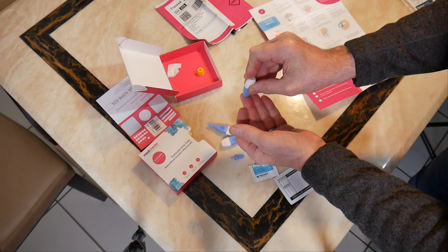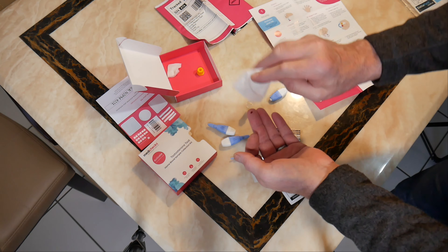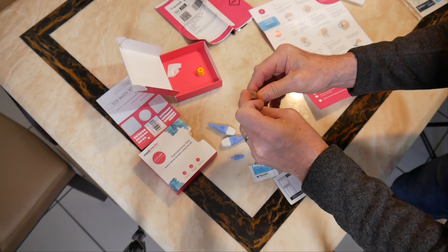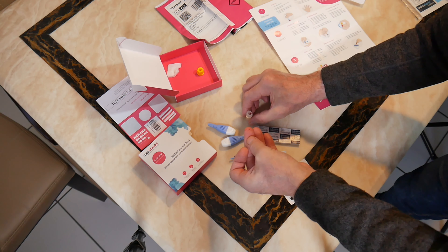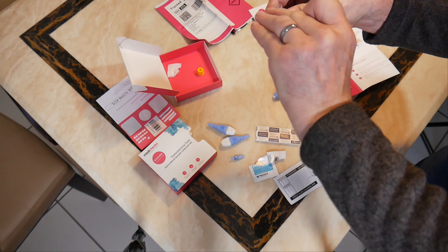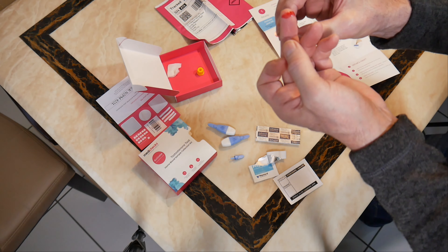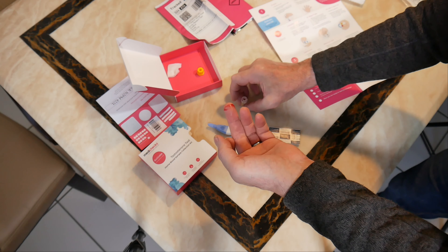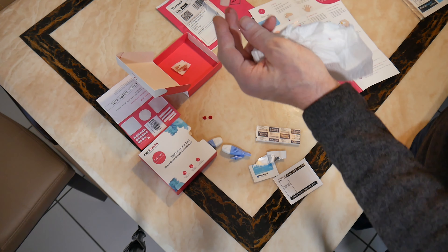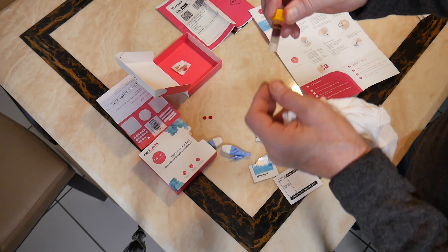Apparently you've got to get rid of the first bit of blood, and then the rest flows. It's coming out quite quickly because I warmed my hands and drank plenty of water — I'm getting plenty of blood. It took me probably about three to five minutes to fill it to the upper line. I finally got it there — tipped a bit on the table, I was fuming — but there we are.